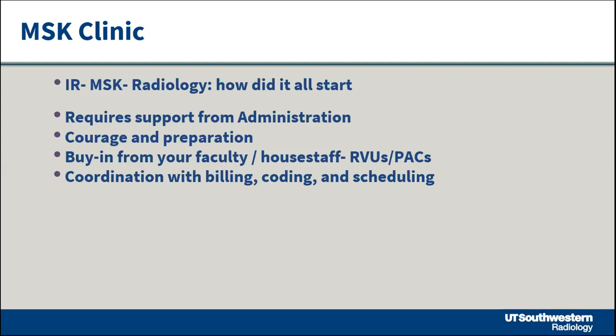The next thing is that you want to have buy-in from administration to have a PACS station in that clinic. So when you're not seeing patients, you can read studies. You have to coordinate with your billing, coding, and scheduling people.